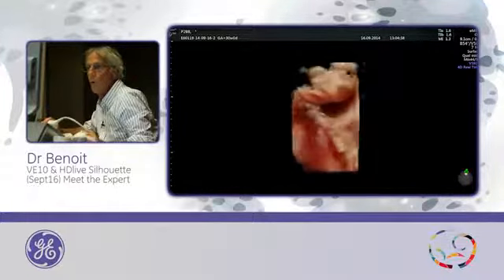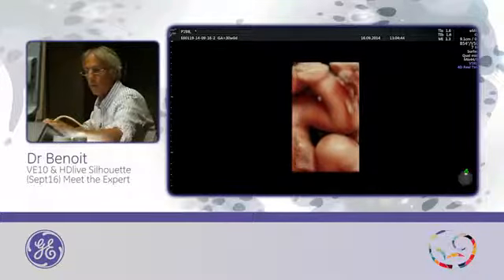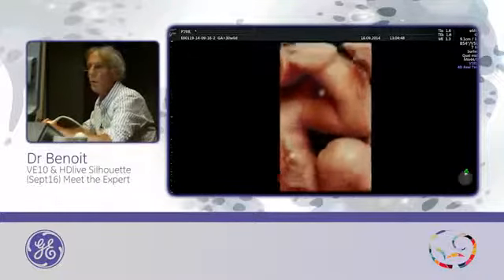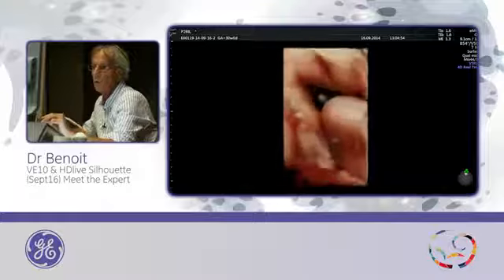So now it's more real time than with the previous probe, because with the other probe, it was around 2 to 3 volume per second to obtain this quality.